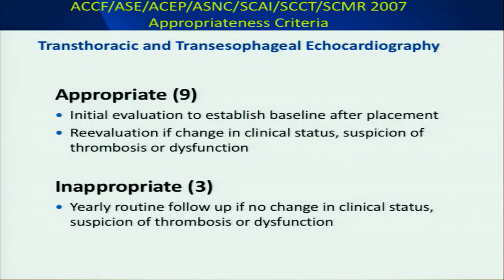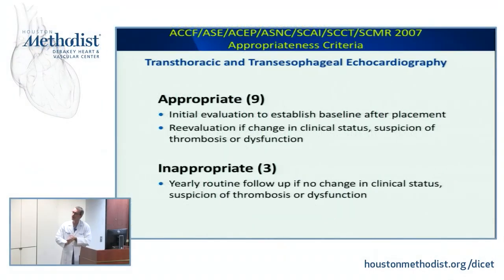So TEE is appropriate, easily, anytime you're really concerned clinically about a prior prosthetic valve, or any prosthetic valve, or if you have transthoracics showing changes that you need to explain. So a very low threshold to do a TEE, particularly on a mitral case.